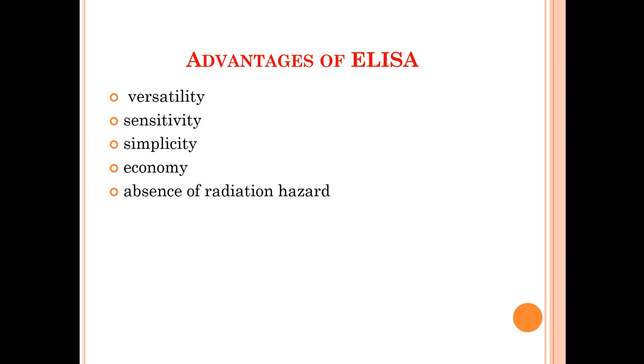It is highly economic as compared to other tests, and there is no, we can say, hazard of radiations. Okay, and therefore the test is most commonly used and the most popular test for diagnosis of a variety of different diseases.